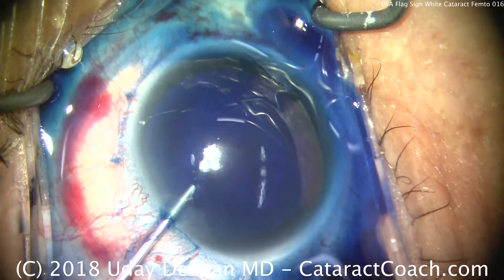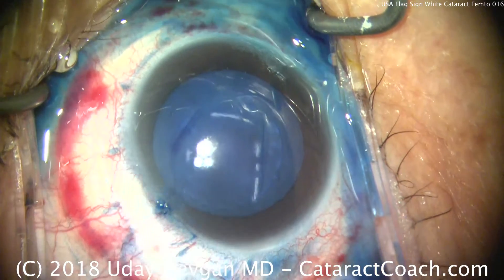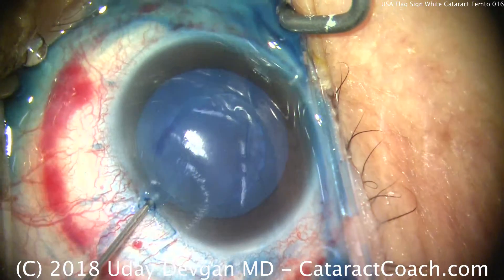It's Dr. Devgan, your cataract coach. For a white cataract with what I call the USA flag sign — do you see the red, the white, and the blue?